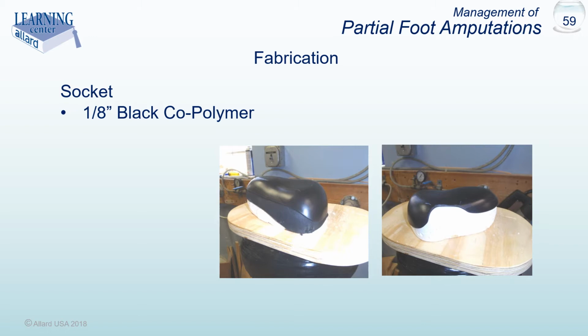The socket helps contain the residual foot to minimize the splaying of the foot. It also serves as a base to which posting or wedging is applied to help restore limb length.